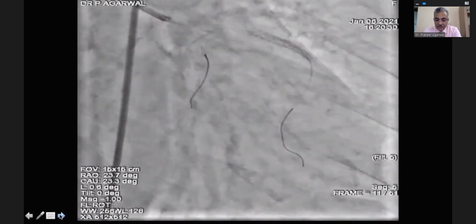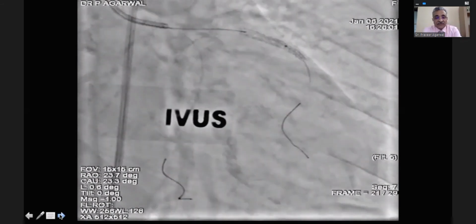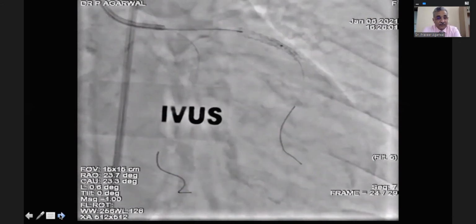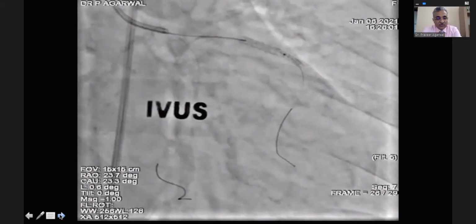With the IVUS, we just see the morphology. So in IVUS, what we saw is that the diameter of the proximal LAD is about 3.75, and the left main is measuring around 5.5 or maybe 5.6. So there is a great discrepancy in the size of the distal LAD, proximal LAD, and that distal left main.